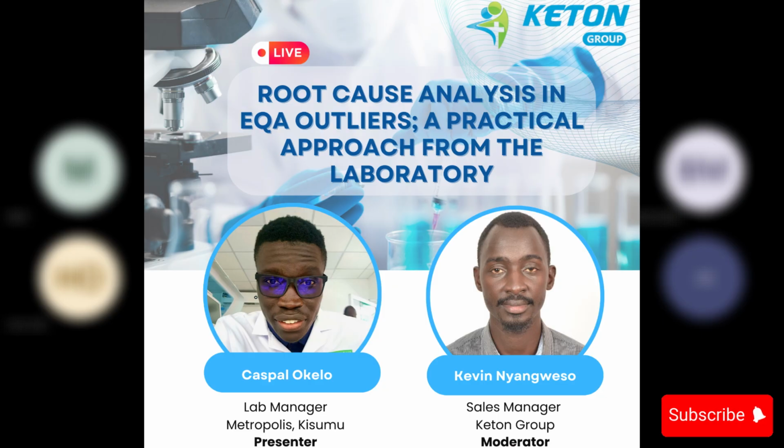The frequency, as I've mentioned, you can do 3 levels. Short-term check within 1 month, that is 1 week to 4 weeks. Medium check within the next EQA sample, if it is within 1 to 3 months. Then long-term confirmation, 3 to 6 months or 1 year without any recurrence. So for high volume tests, you need to increase the frequencies. Tests like CBC or chemistry, you increase the frequencies.